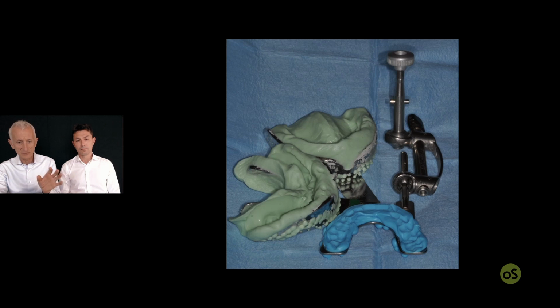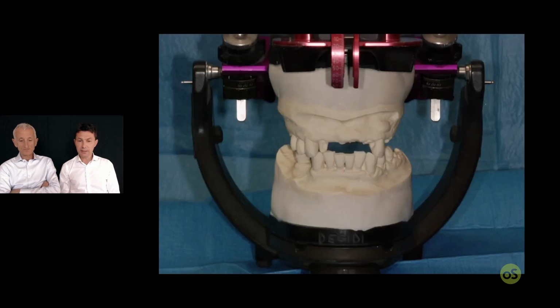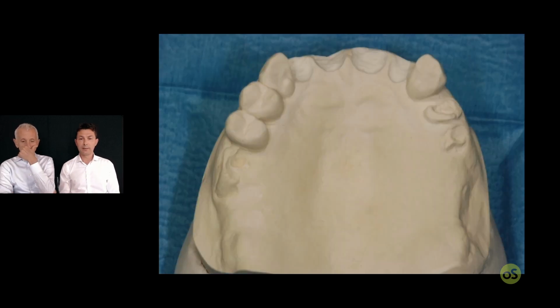So Gianluca will get this information together with other information, like if I like the midline where it is, or if I want to shift this, if I want a different color, a different length, shape, orientation, smile line, and so on. But in this particular case, the patient doesn't have the incisor, but has the cuspid, and that for sure is a good help.